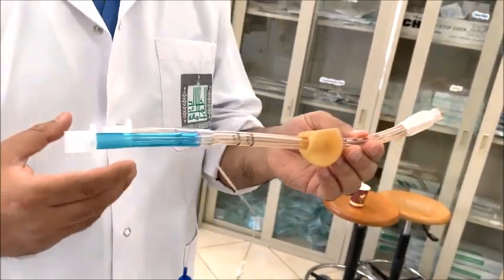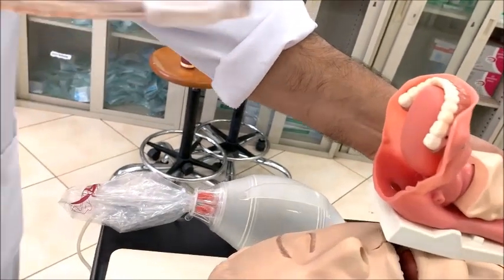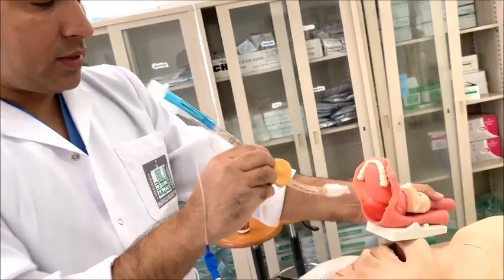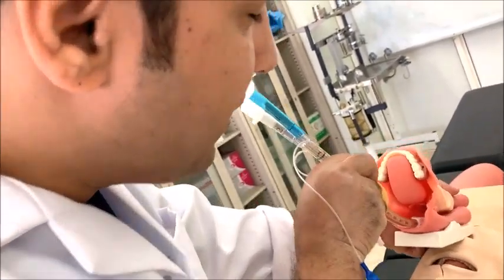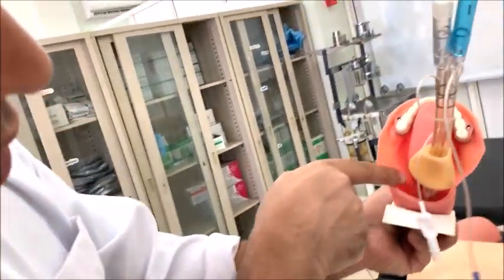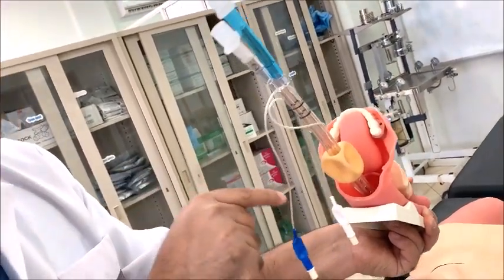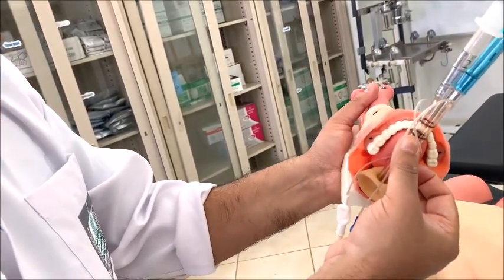The technique for inserting the Combitube: we have to insert it blindly. So blind insertion is required. As I said, there is a 95% chance it will go into the esophagus. You can see here — above is the epiglottis and vocal cords, and below is the esophagus. So 95% of the time, if you put it blindly, it goes into the esophagus. The depth marker must be kept at the incisor levels.